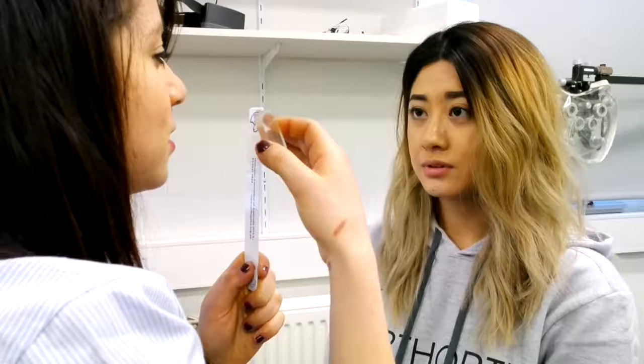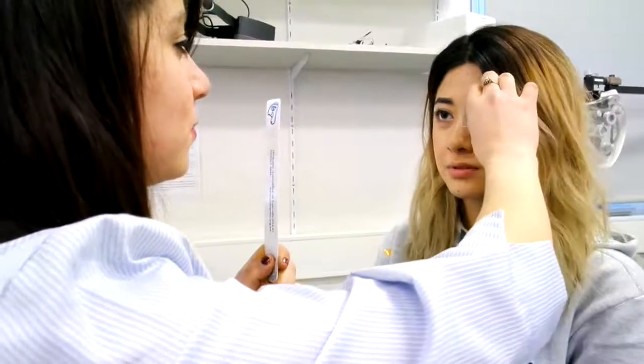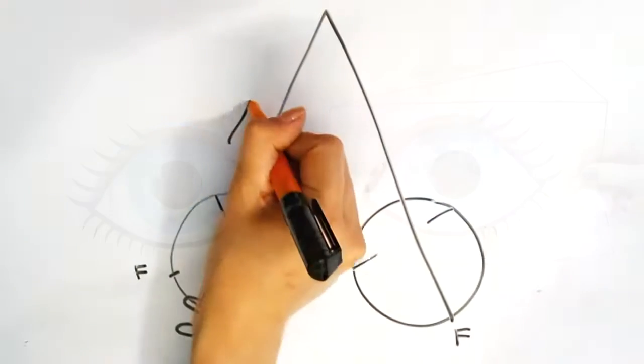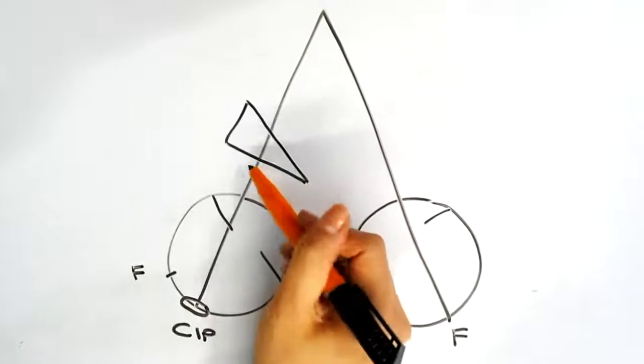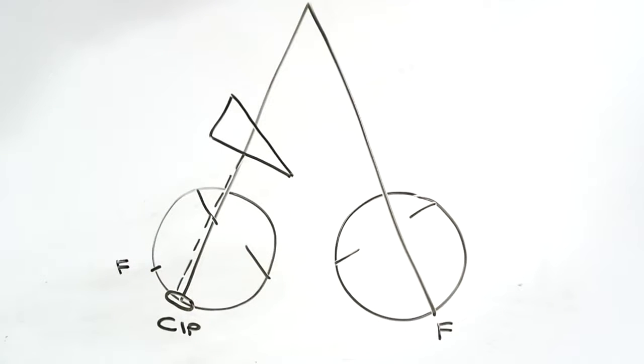Can you just focus on the top letter for me here, please? Sure. Thank you. When the prism is placed over the deviating eye, you will see no movement from either eye. We don't see a movement here as the prism has moved the image onto the extended Panum's fusional area. Therefore, there is no drive for the other eye to make that conjugate movement.